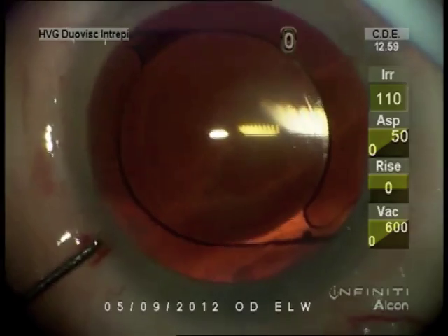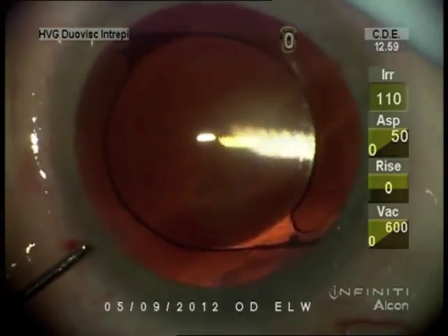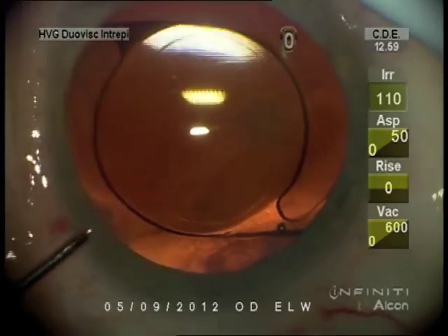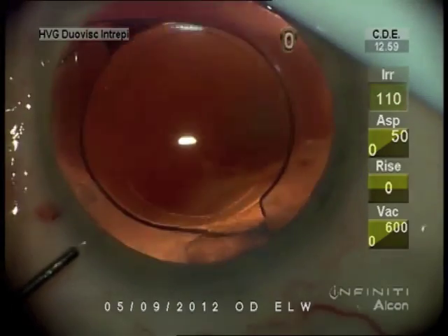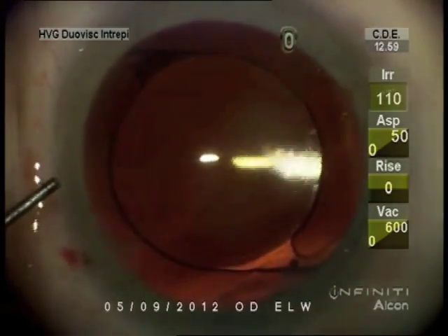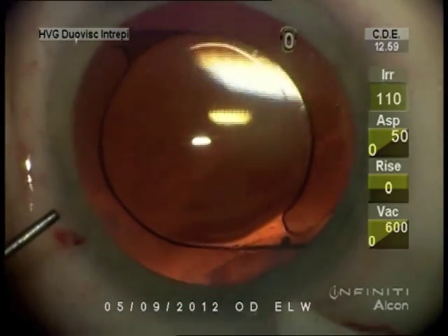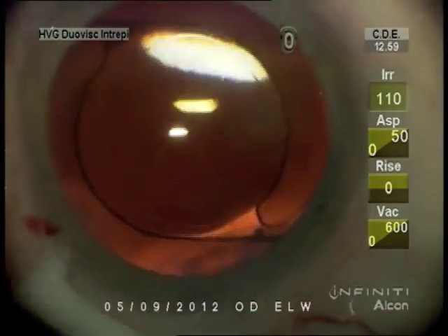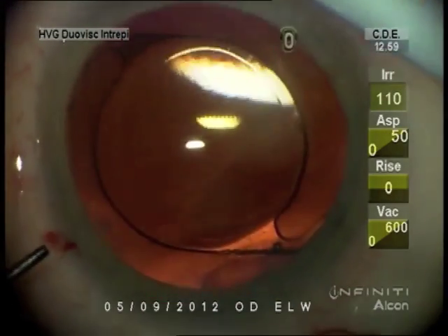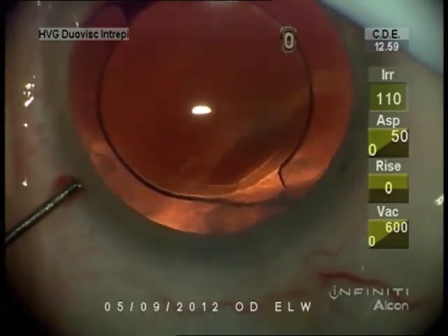So I'm checking the pressure with this end of the Weck-Cel sponge and adjusting the wound, or tapping the wound to let off aqueous till the pressure is right. I like to start with it high, which confirms the wounds are sealed, and then bring it down to normal.